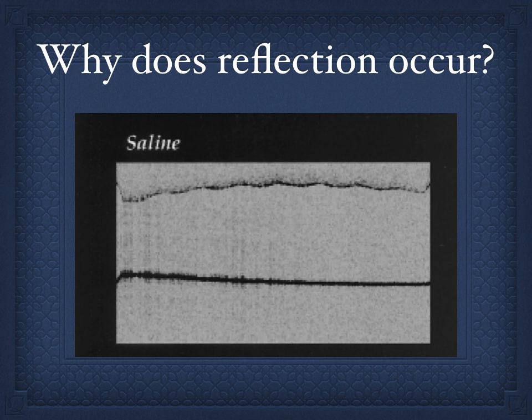So why does a reflection occur? This is a basic principle. You don't get reflection if there is not a difference in the refractive index. And we discussed the concept of a refractive index in one of the previous OCT physics lectures. So the refractive index of air is 1, saline 1.35 roughly, and the reflector is greater than 1.5.